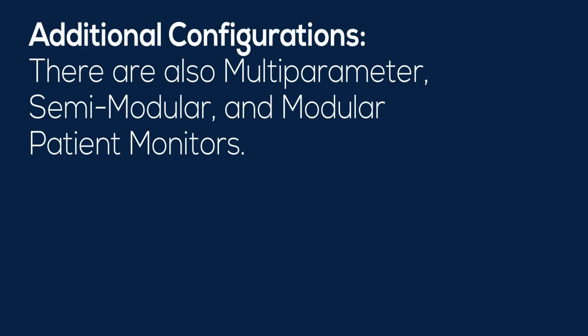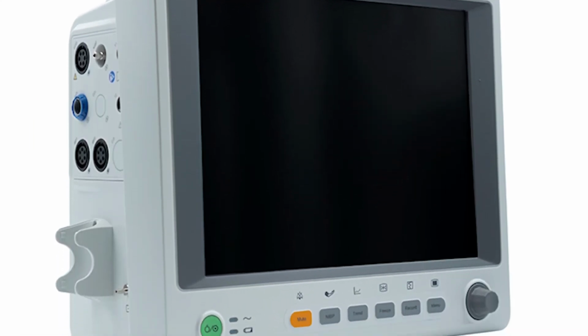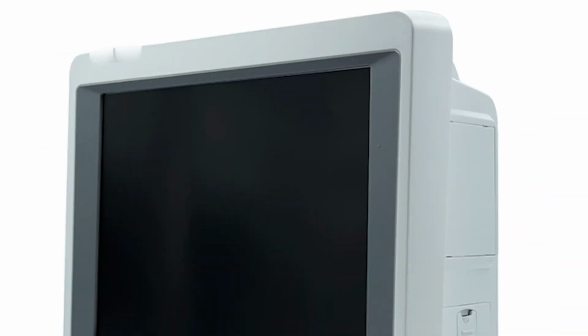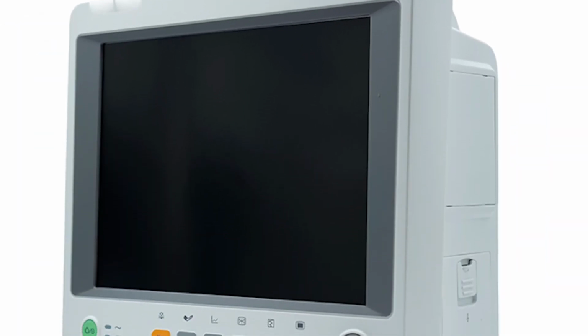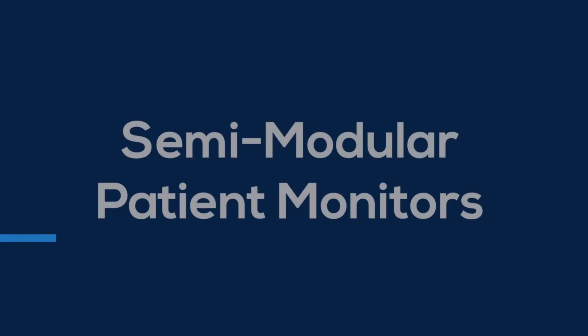There are also multi-parameter, semi-modular, and modular patient monitors. The majority of monitors in the market are monitors that feature fixed parameters from the factory. They cannot be configured or changed based on the customer's needs. In some scenarios, you can add CO2 at a later date with an external module.